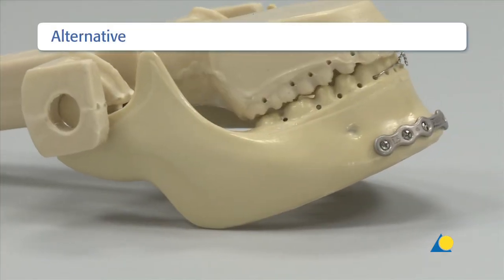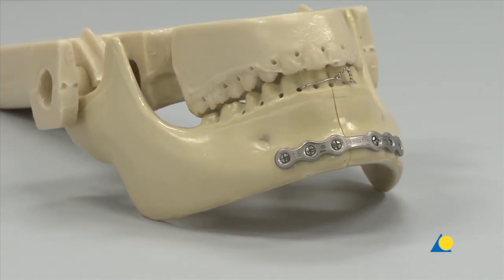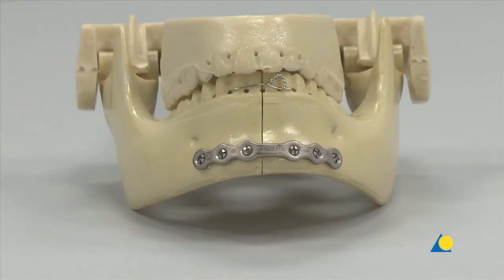One alternative would be a 6-hole, 1.5 mm thick matrix mandible straight plate placed along the lateral aspect of the inferior border using 2.0 mm locking screws inserted bicortically. This technique requires a stable arch bar to be placed across the fracture line. The arch bar must be maintained for 5 to 6 weeks to provide a second point of fixation.